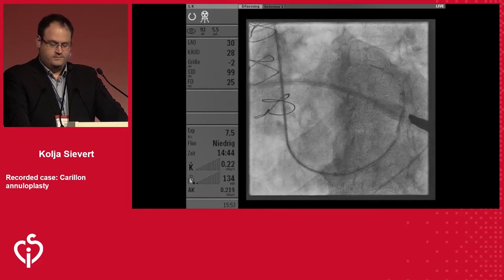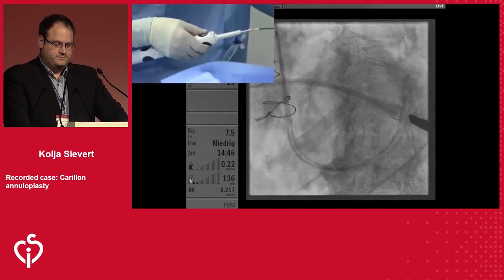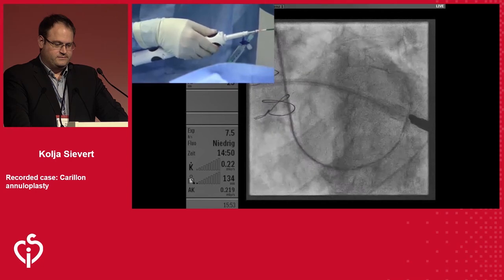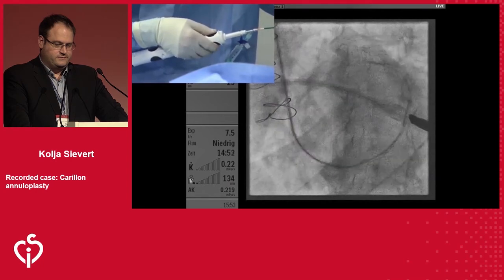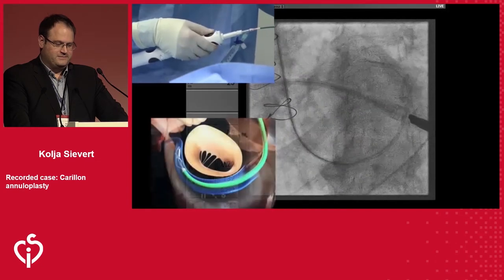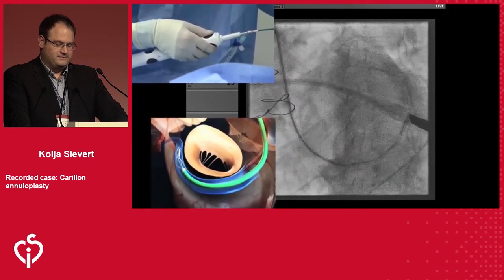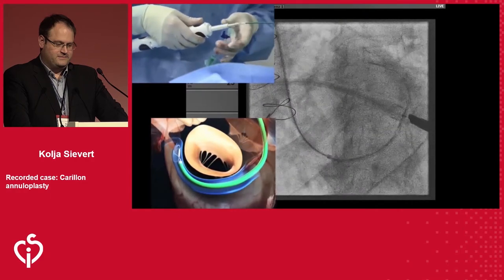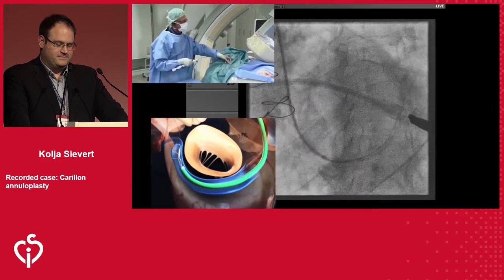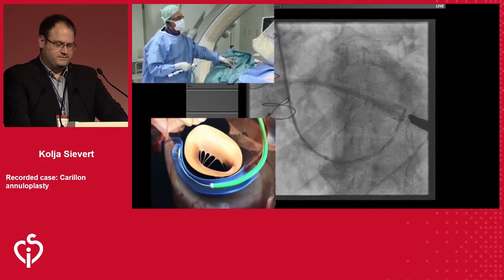I have to go another about 2 centimeters from now on. Yeah, so here's the proximal crimp tube. We want to take the tip of the delivery catheter right about to the center of the proximal crimp tube there. Right where the blood pressure cuff is overlying things. Exactly. So I think that should be fine now. Perfect, yeah. Okay. So now I'm ready to pull on the whole system, including the guiding and the device.